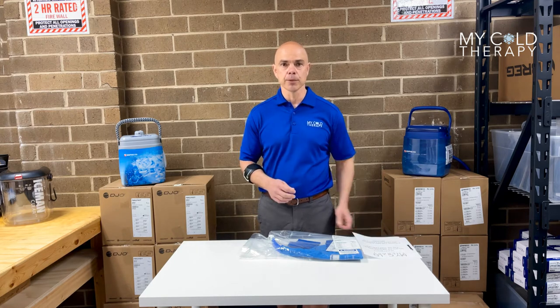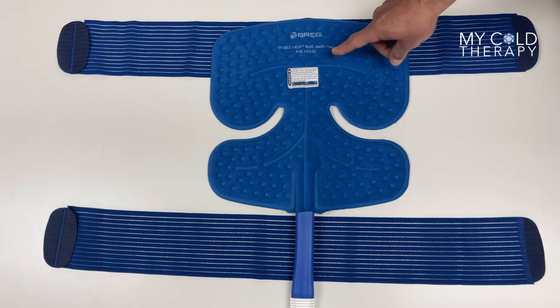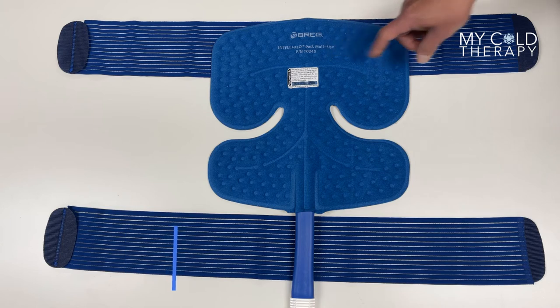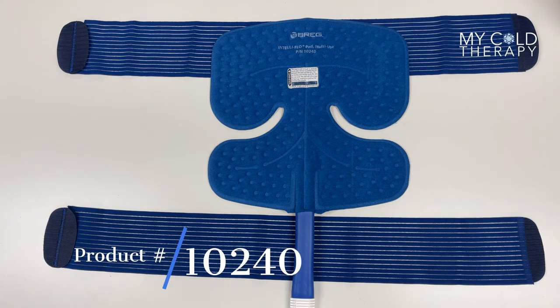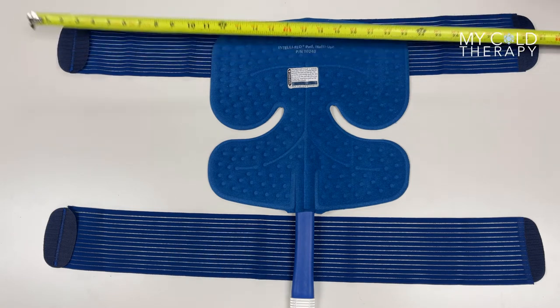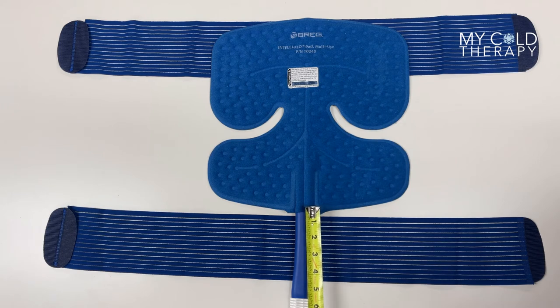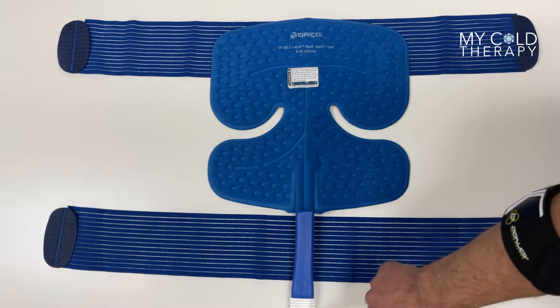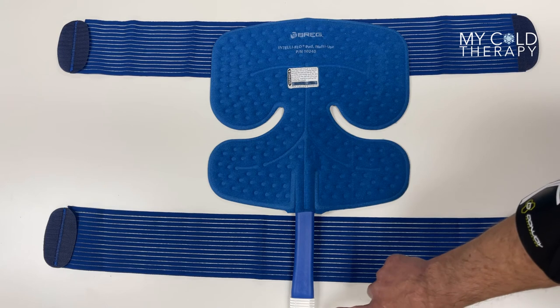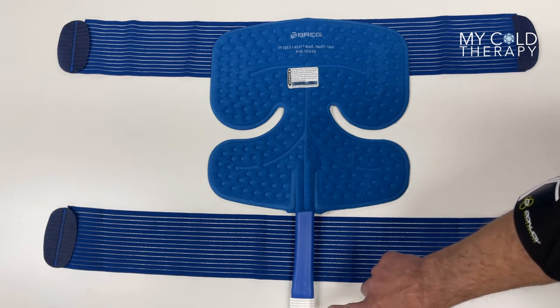Now we're going to talk about the dimensions of the pad. Every pad comes with a part number written on the front — in this case it's the Intel Flow Pad Multi-Use, part number 10240. This pad comes with two straps; both of the straps are 30 inches long. The hose on this pad is 6 inches long and please take note of the connectors. This is a Kodiak pad so it has a male and a female connector, that way you know you have a Kodiak pad.